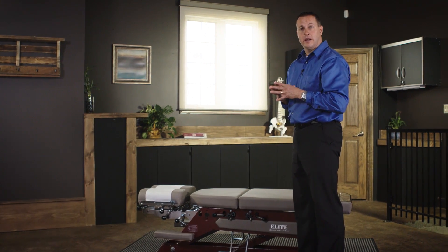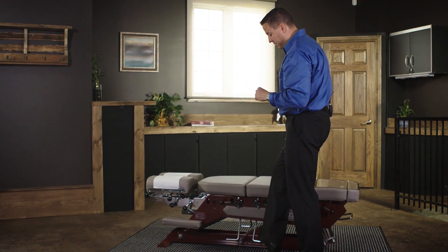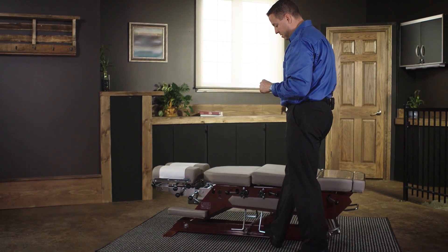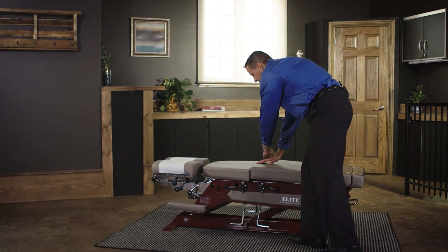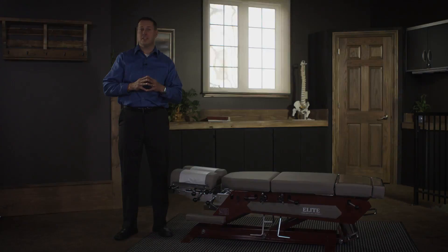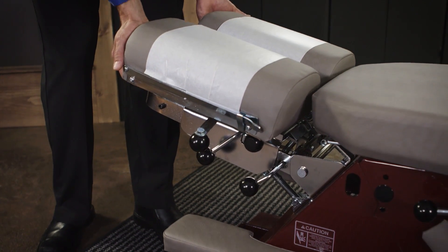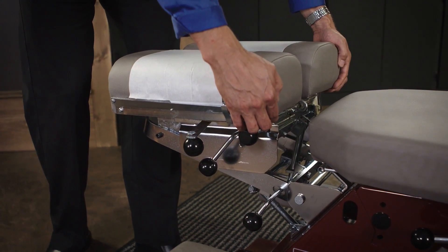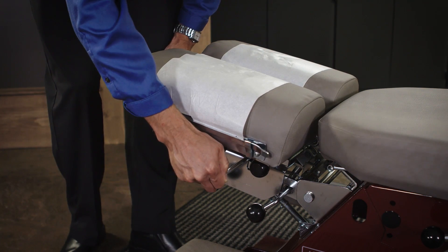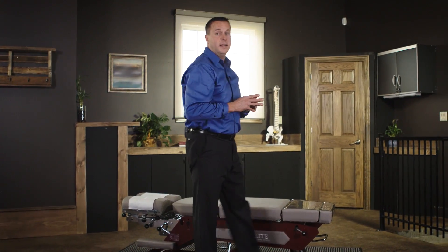The foot cocking mechanism is located on both sides. In order to set the drop, simply step on the pedal and the drop drops down. Each Elite table comes with a multi-directional headpiece which will tilt, elevate, spread, and drop. This is the Elite Pump Elevation table shown with three drops.